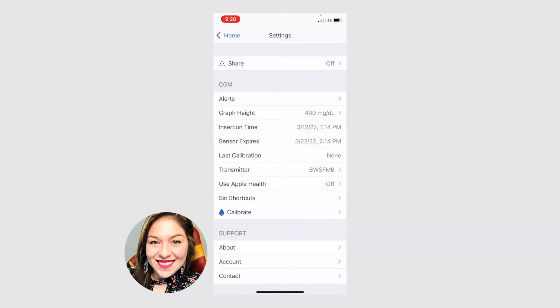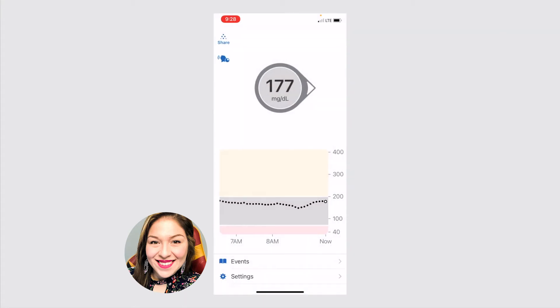These are just some of the major highlights of the G6 app. So again, this is the app that shows you what your current readings from your sensor are to your phone.